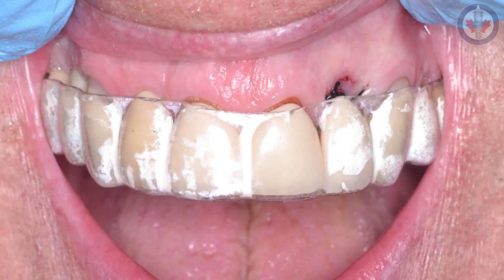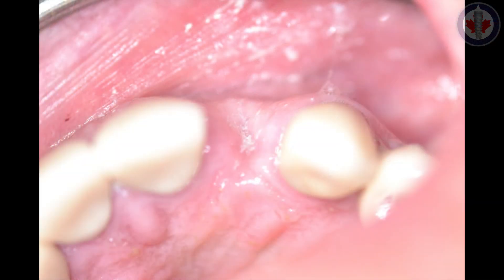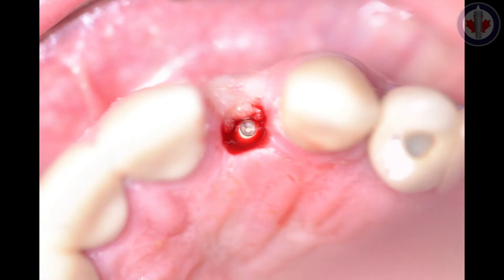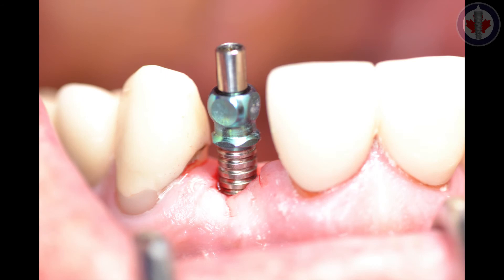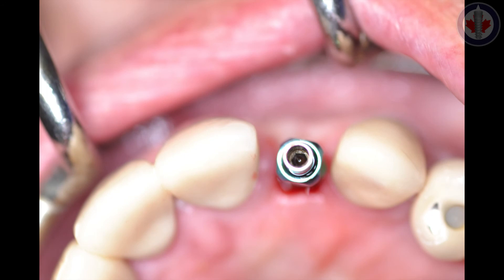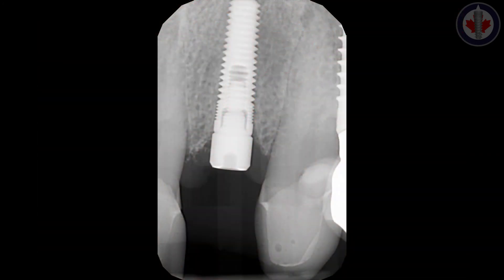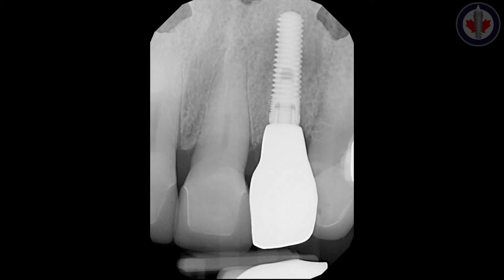The patient comes back in a week and we remove the silk sutures. Six to eight weeks later, we bring the patient back for a Stage 2 procedure. We perform a roll flap along with a horizontal mattress suture to retain the connective tissue on the buccal aspect, giving us a nice emergence profile and a three-millimeter straight or contoured healing abutment. We then take a fixture-level impression of the implant in a screw-retained position. Once the lab has fabricated the crown, we insert it — it fits really nicely — and bring the patient back after a week to confirm everything is good.